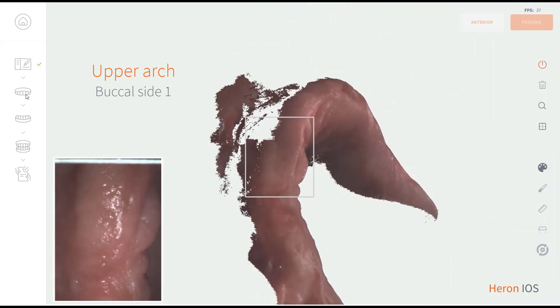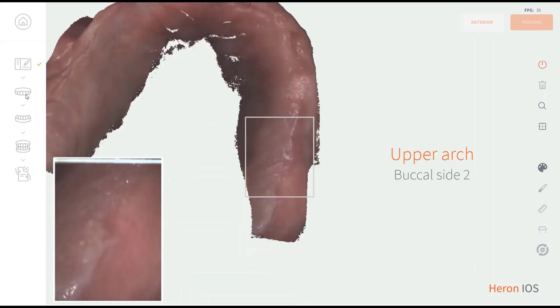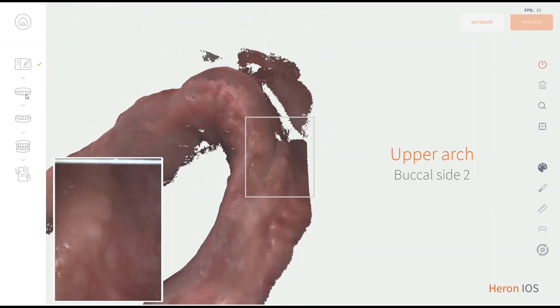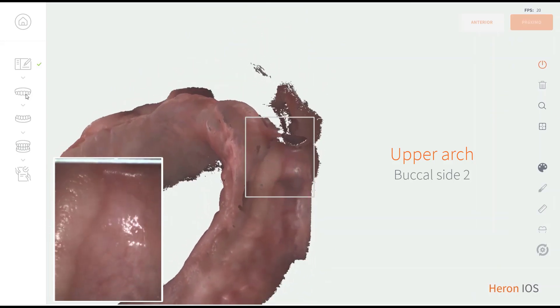Start by scanning the full occlusal surface of the upper arch, then scan buccal in two segments, one per half arch, from the back to the front. Always try to keep the ridge in the center of the scanning window.